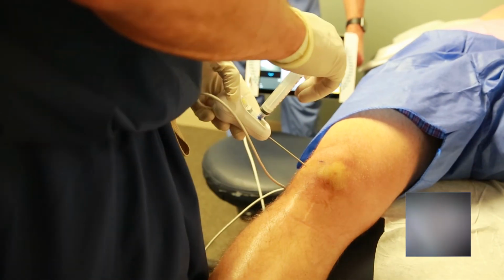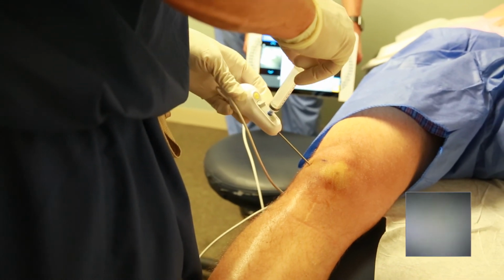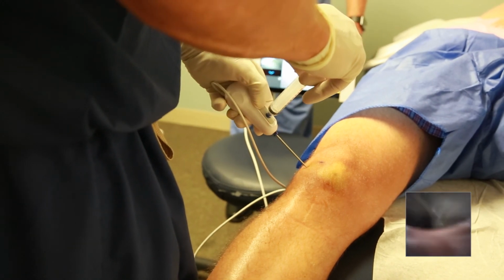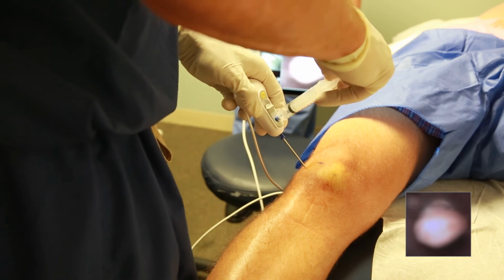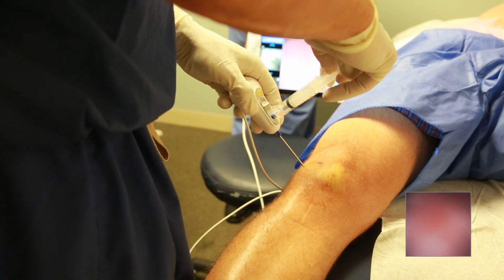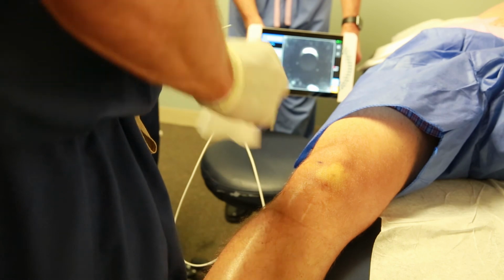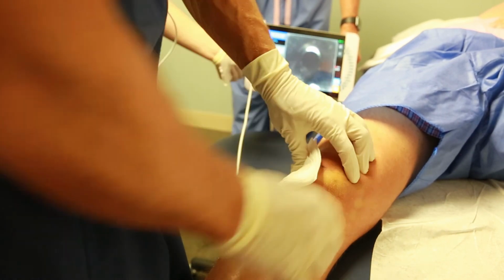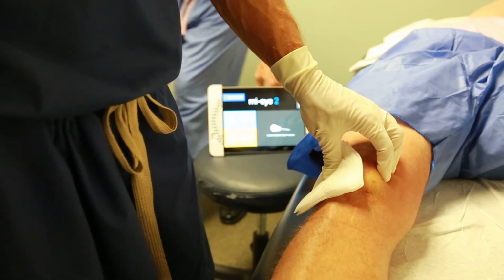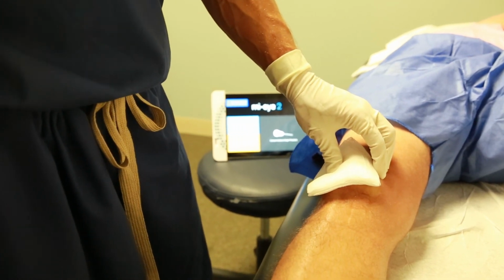Okay, and then when we're done, what I like to do is suck as much water as I can out, and sometimes you can get more and sometimes you can't. Sometimes it's easier to suck water out with the scope pulled back, and then once you finish, we just pull out. He is going to drain a little bit, and you can see he had no pain, and we were probably in there 5 or 6 minutes. He did fine, and we got what we needed to do.